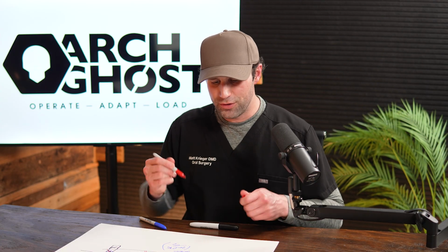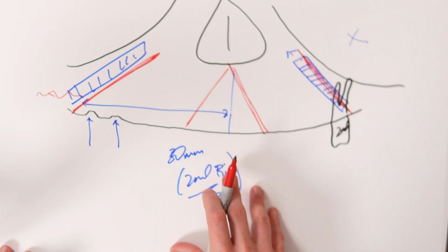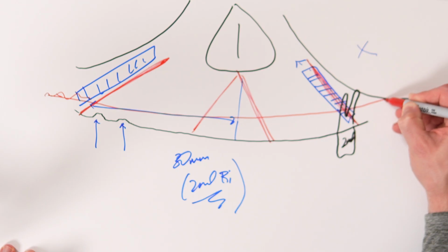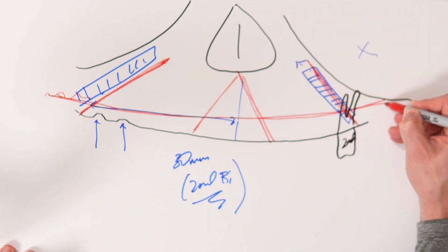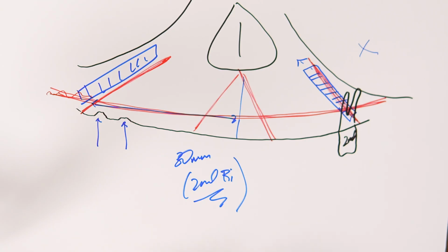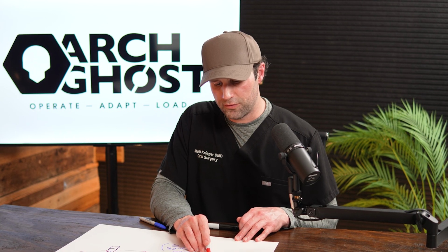The reason that I'm going to do that is after you do your reduction, if this red line is going to come through here, I guess it's not squiggly because we want a smooth line, but if you're going to do your reduction and you reduce across here, guess what happens? Now on the left side, you'll have a little bit of the socket left. On the right side, you'll no longer see this.